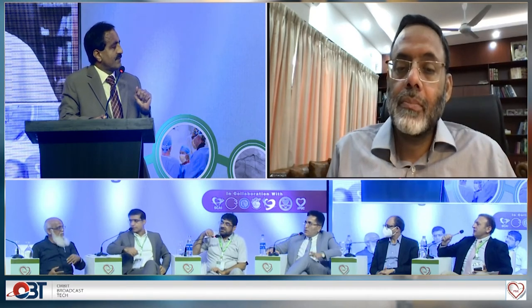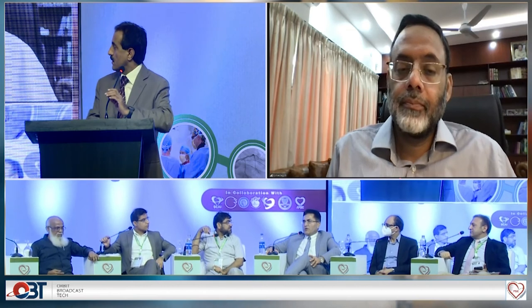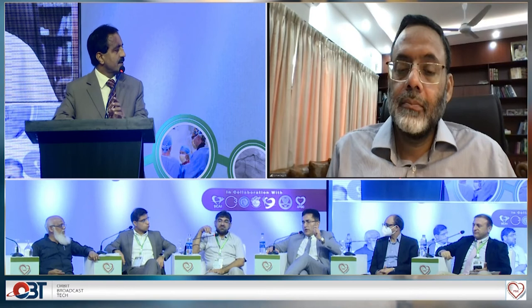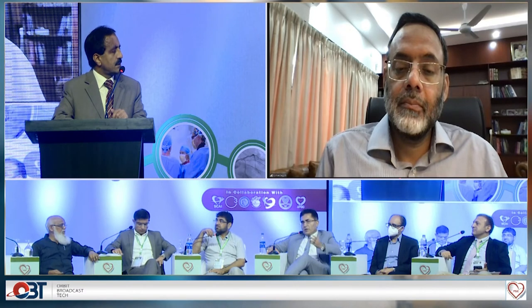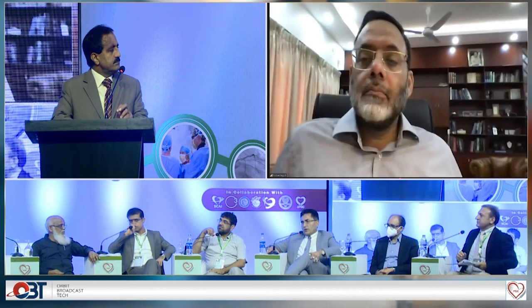I think one thing very important, we have to be very good at the basics. We have to look at the cause of why it happened. Every case should be taken seriously in the cath lab, whoever is doing it. Once we are wiring, the distal part of our wires should be in a very safe zone. Diagonal is a branch of LAD, so we don't need to go so distally to see such a scene. The basics should always be right to avoid such complications, such nightmares.